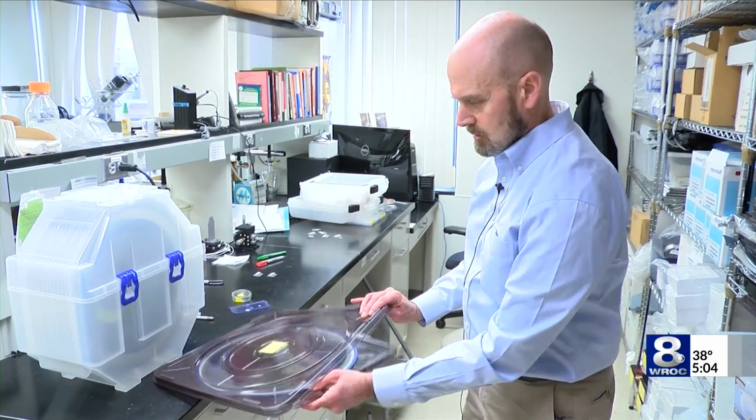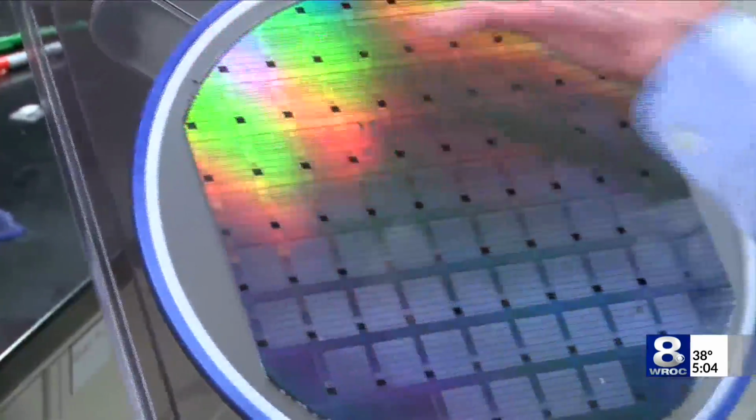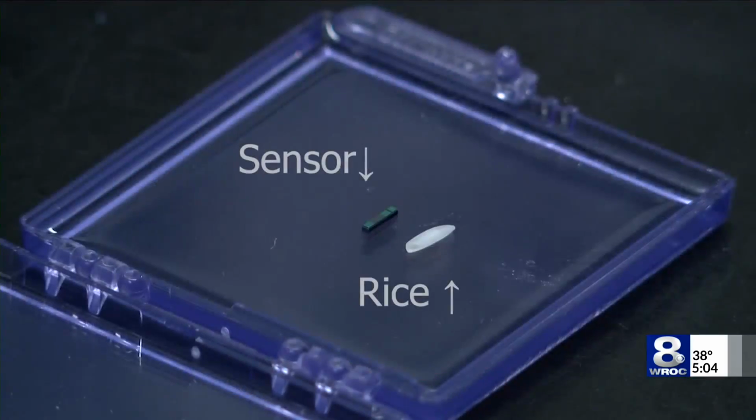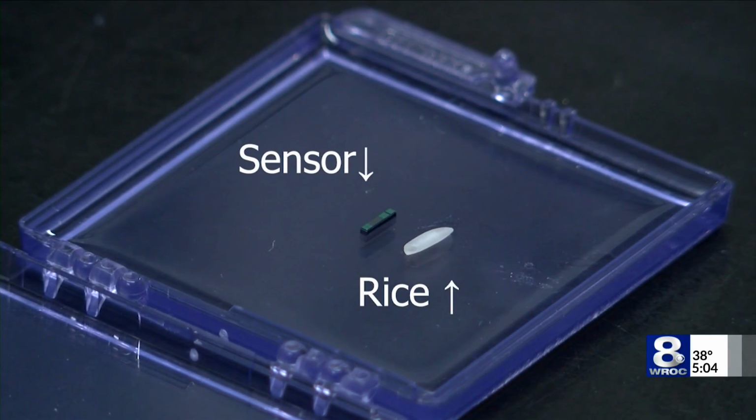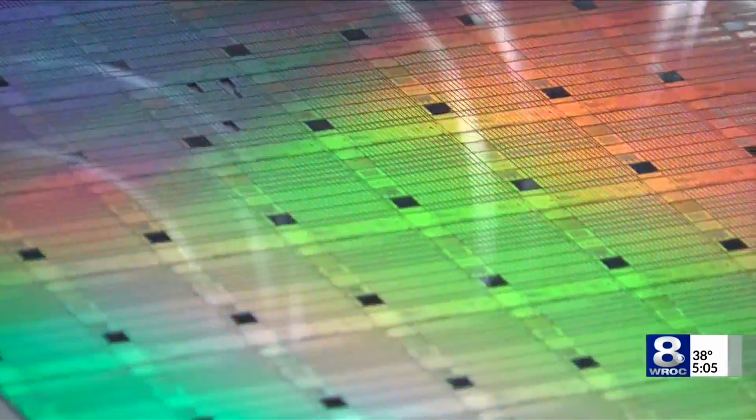Ben Miller is a professor at the U of R and leading the research effort to develop sensors that will measure human immunity to COVID-19, specifically being able to determine immunity as new variants of the virus continue to arise. As new variants of COVID-19 arise, can we understand whether someone who's been vaccinated against the original COVID-19 still has immunity to these new variants? And we're doing that by developing very simple, inexpensive sensors based on photonics that we manufacture at AIM Photonics.